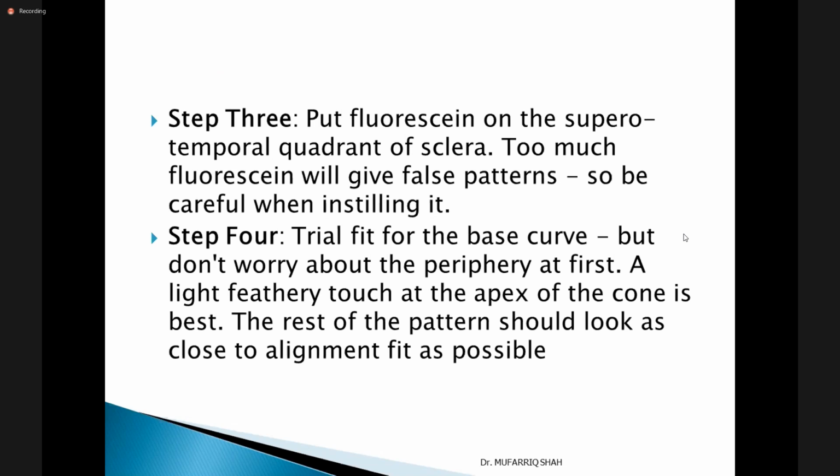Step 4, trial fit for the base curve, but don't worry about the periphery at first. A light feather touch at the apex of the cone is best. The rest of the pattern should look as close to alignment fit as possible.